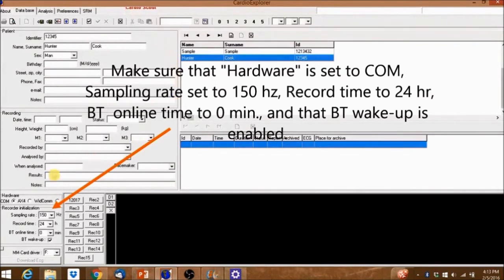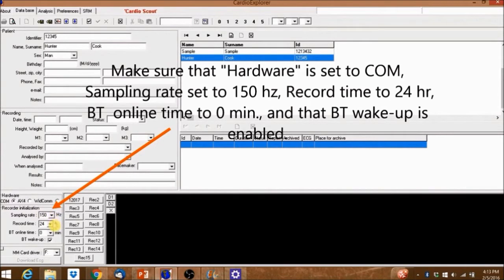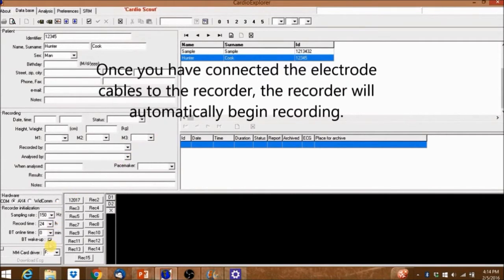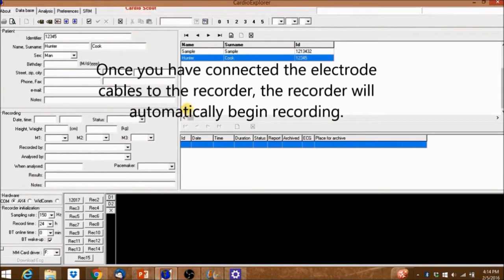Make sure that hardware is set to COM, sampling rate set to 150 Hz, record time to 24 hours, BT online time to 0 minutes, and that BT wake-up is enabled. Once you've connected the electrode cables to the recorder, the recorder will automatically begin recording.